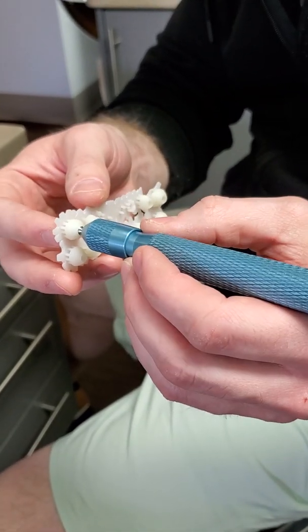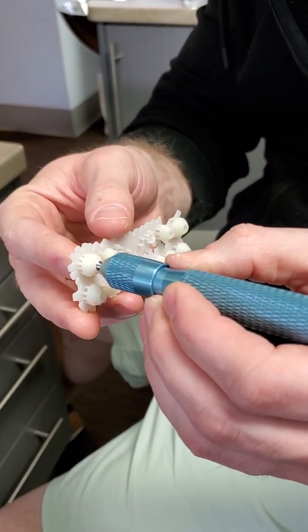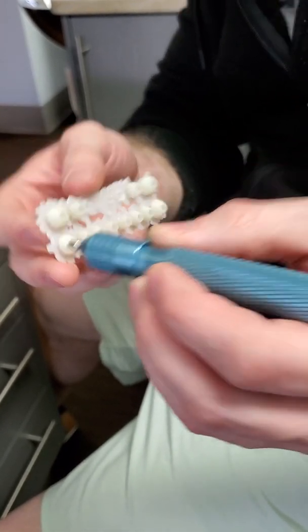All we want to do is occupy that space. If you were to print it smaller and you could press it in there, you might get to skip cementing entirely, which would be awesome. But that's going to be a little bit more tedious. You might get to the point where you can't fully seat it, and that can be frustrating.